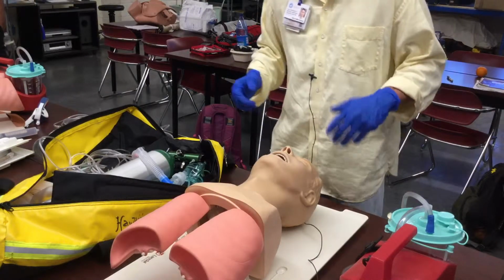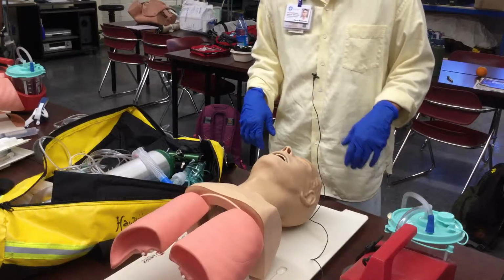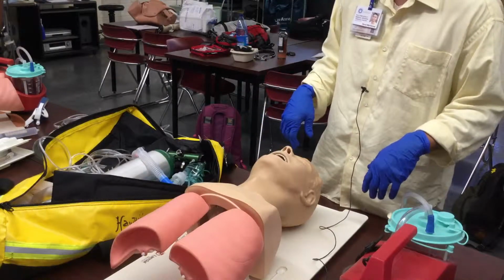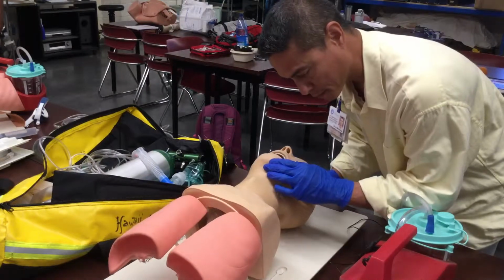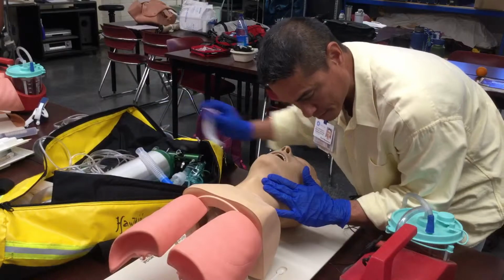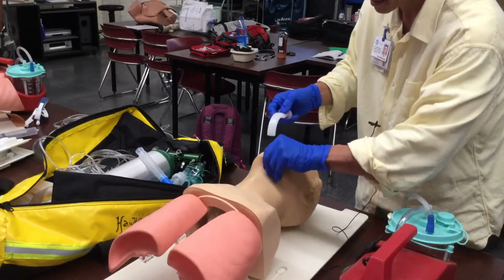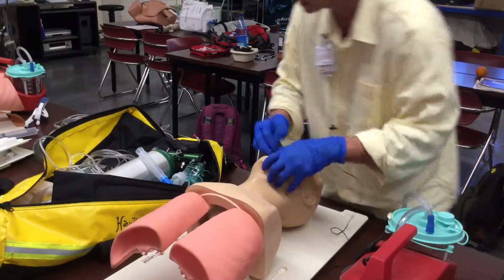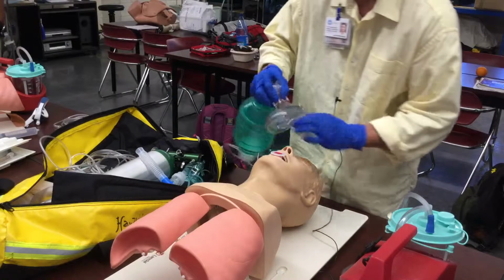Okay. You are dispatched to a difficulty breathing case. Upon your arrival, your patient is unconscious with slow and shallow respirations. A carotid pulse is present. So slow and shallow breaths, I'm watching rise and fall. I go ahead and open the airway, maintaining that I have a pulse, and I'm listening to the respirations. I'm going to use the tongue-jaw lift and insert an OPA. And then I want to start ventilating my patient with the bag valve mask.